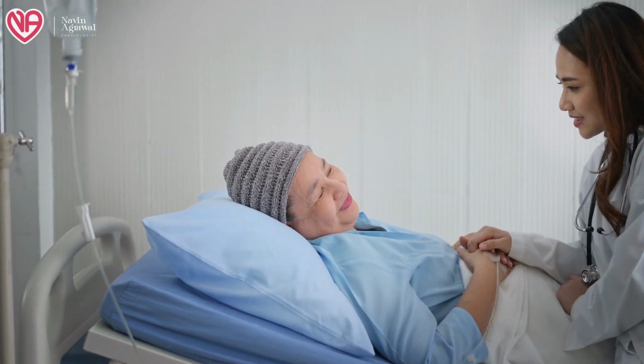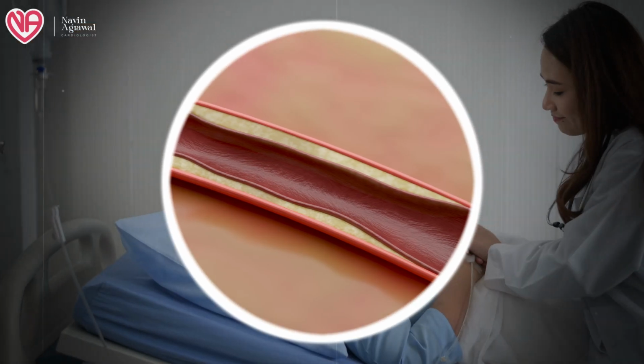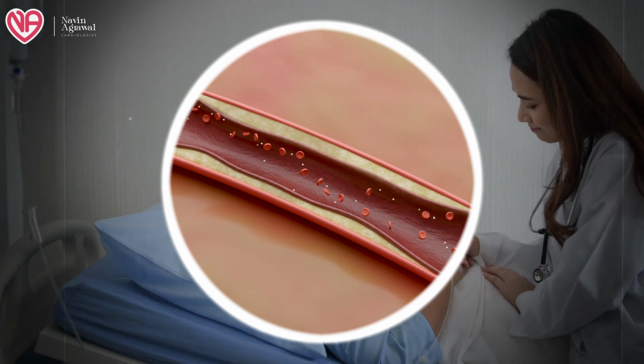Calcium scoring is just useful as a screening tool, and that too in very young patients, where we just want to use it for screening purposes and we do not want to inject contrast. Therein the role of CT calcium scoring is high. But if at all the patient is already having some disease, or is an elderly patient where the vessel is already calcified, in these cases the role of CT calcium scoring is much less.